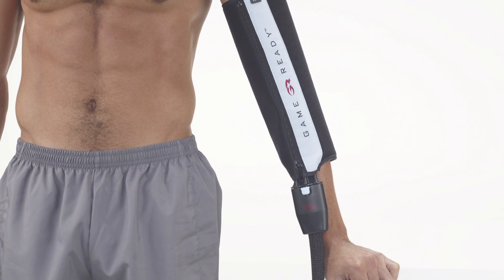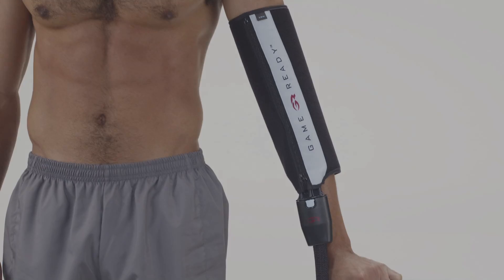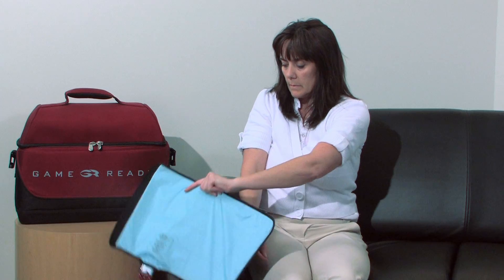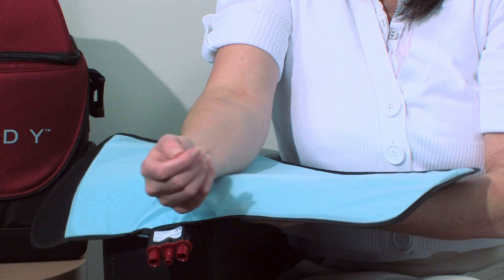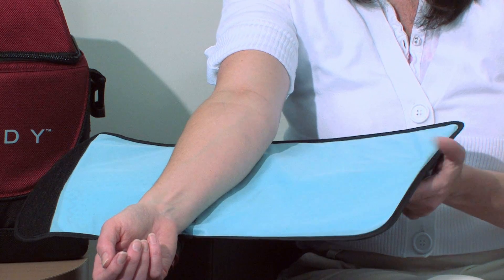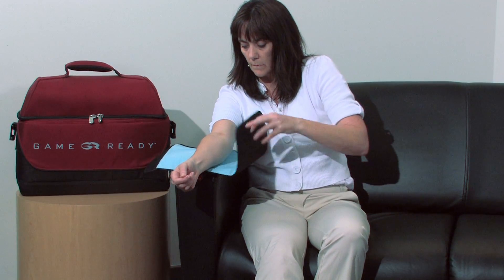This video will demonstrate how to apply your elbow wrap. To wear the wrap on your elbow or forearm, place the unfolded wrap on a table or hold it against your side with the blue side facing your arm.